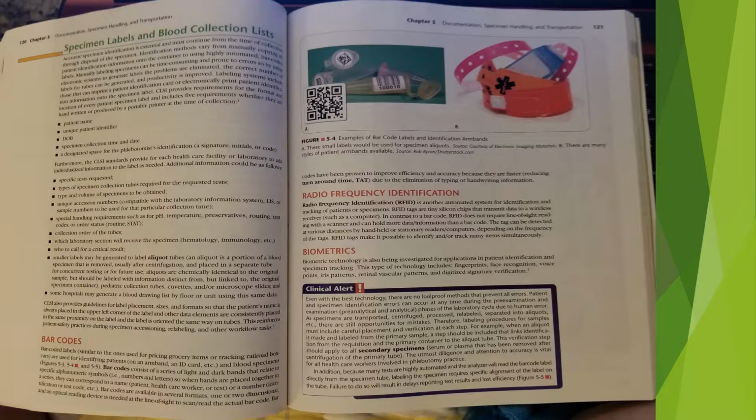CLSI also provides guidelines for label sizes and formats so that the patient's name is always placed in the upper left corner of the label and other data elements are consistently placed in the same proximity of the label and the label is oriented the same way on the tubes. This reinforces patient safety practices during specimen accessioning, relabeling, and other workflow tasks.